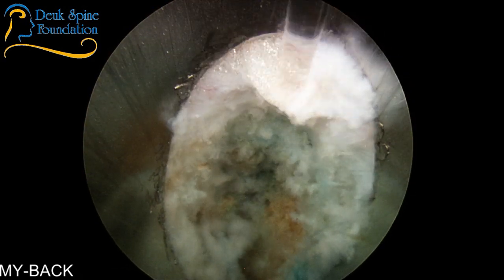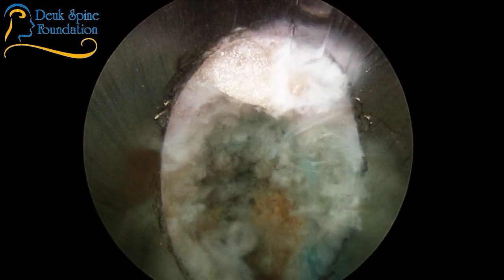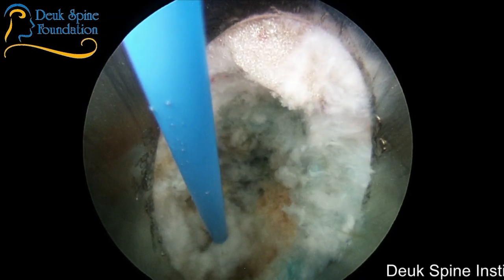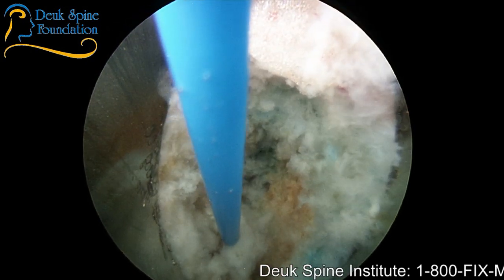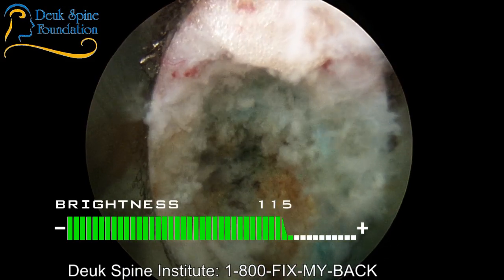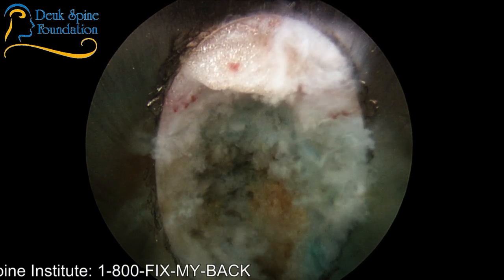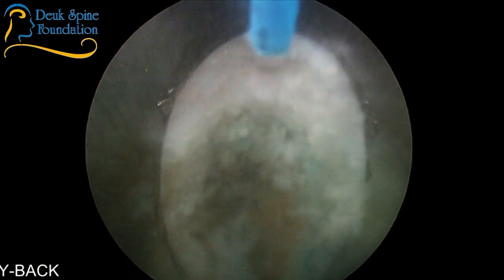Now what you're seeing here is fat. Those are fat cells. You can actually see individual cells. Every one of those little balloons is an individual cell. Let's see if I can focus a little bit better. I think we're just overexposed. Maybe we can turn the exposure down one click. So yeah, each of those little things, you can see them. They look like frog eggs almost. Each one is a fat cell. That's the kind of magnification we're seeing with the endoscope. So we can see right inside the disc.